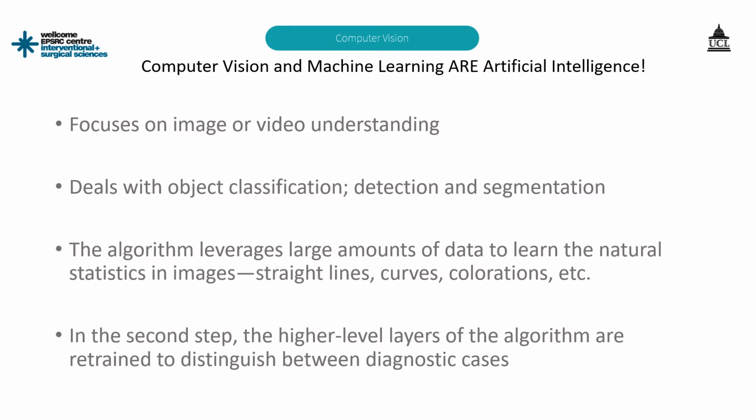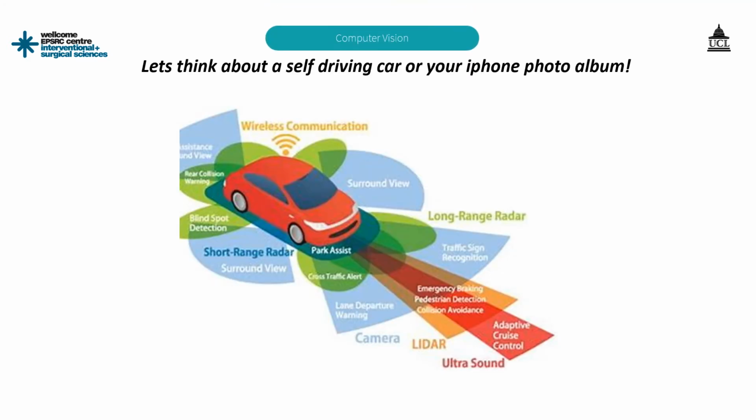So computer vision and machine learning, that's what we're interested in surgery. We take the image or the video and we extract information that it's presenting to us. There is a wealth of information in that video data, from kinematics, the way that things move, to what is in the scene, how much is in the scene. For example, how much red is there? That means is there a lot of blood in the scene? What instruments, what phases we're in? And by using that data, we're able to make meaningful predictions.